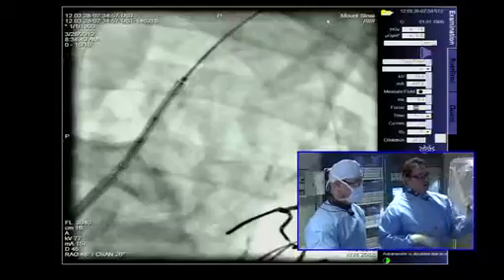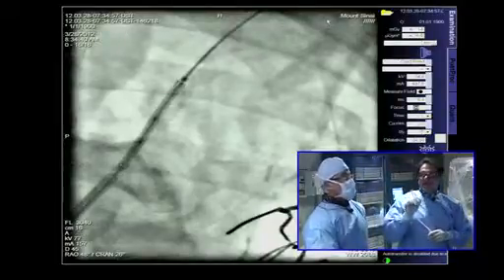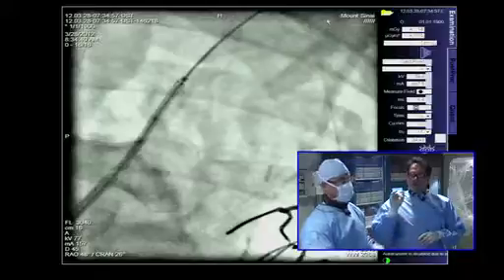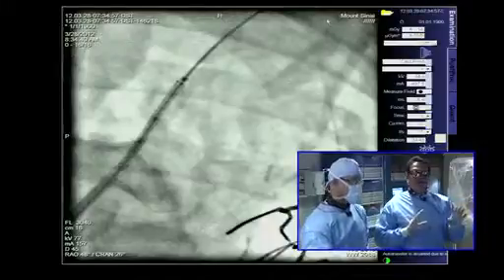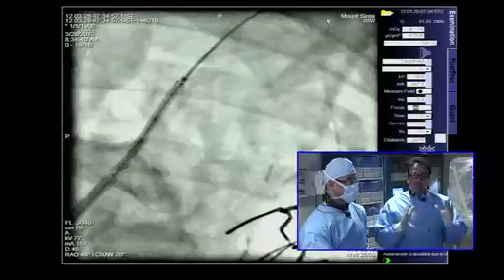Pardon me. One of the things, George, that I really want to get across to the audience is that when you drag these stents back and forth across these lesions, there's a chance you may lose the stent. So you have to be extremely careful when you're trying to pull back and forth on a tight lesion. Now, we moved it across. I think I've got it in the right position. I just want to make very, very gentle movements to be able to place the stent where I like to place it.